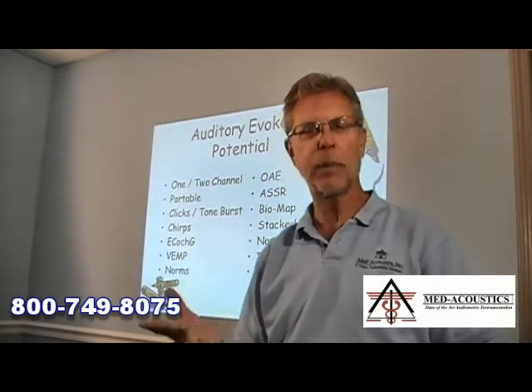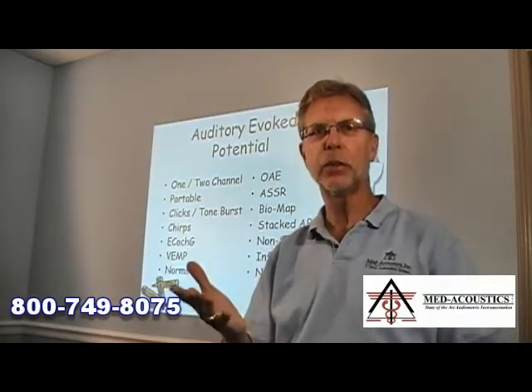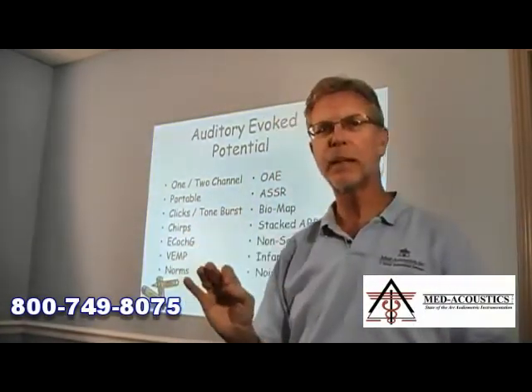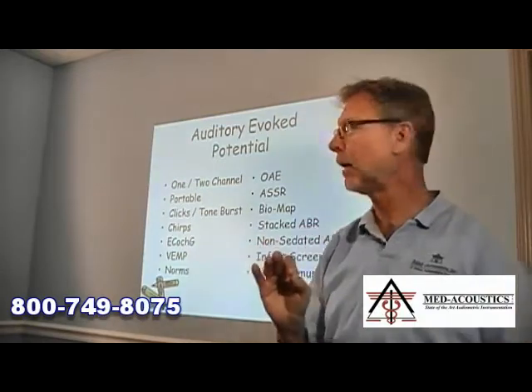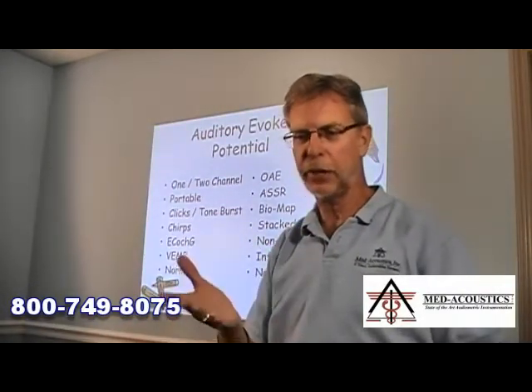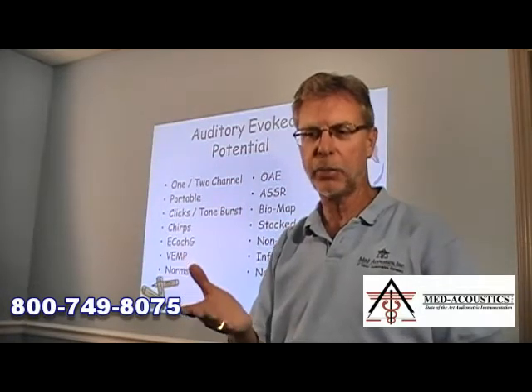And then what type of stimuli do I need? Almost everybody would say, yes, I definitely need clicks, but do I do frequency-specific work, and do I need tone bursts? And then today, if we are doing frequency-specific threshold determinations, then we definitely want to think about an alternate stimulus, a chirp. Okay, and when I demonstrate the Eclipse unit, I'll talk about the advantages of the chirp stimulus. It's an alternative to a click stimulus and a tone burst stimulus.